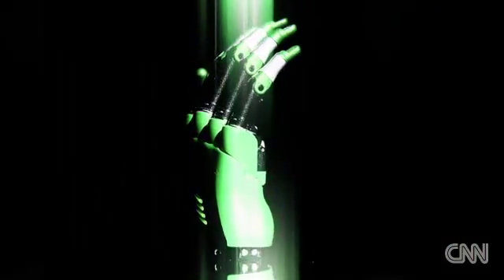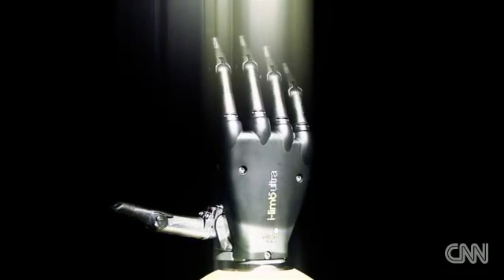Almost as important as the greater range of movement is the look. If you try and shake hands with an amputee who's wearing a prosthesis, it's an awkward moment. But I've noticed that people with the I-LIM hand offer the hand. They're proud of it.